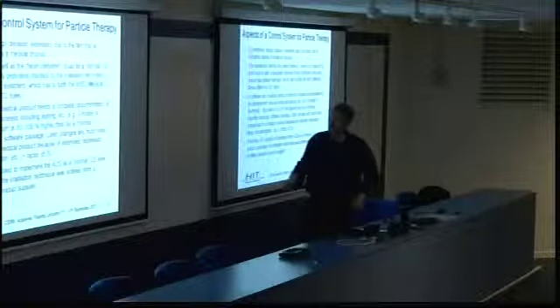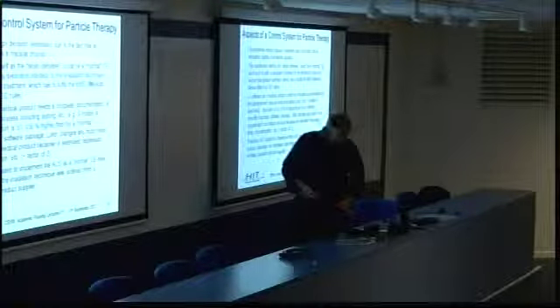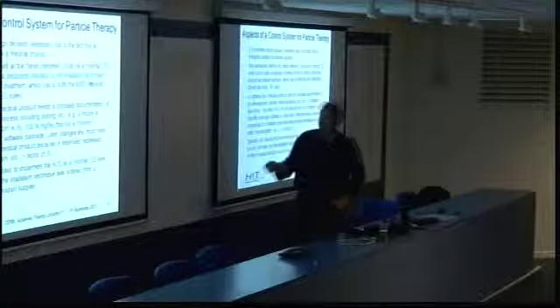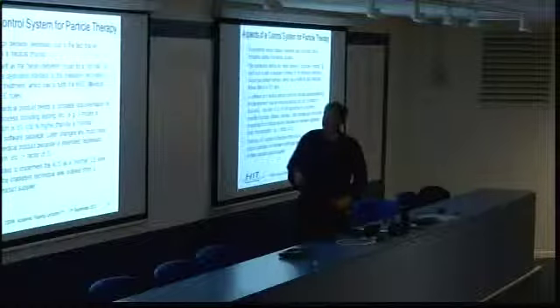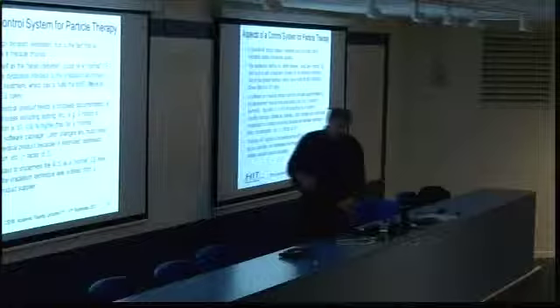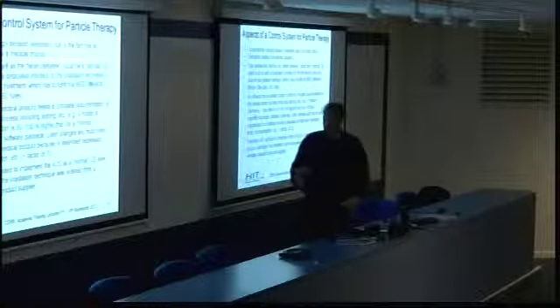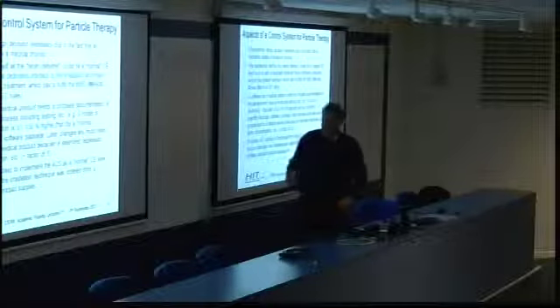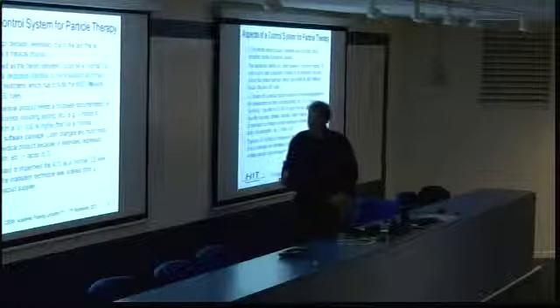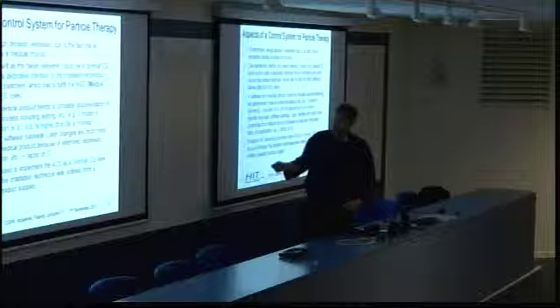I think this is a wise decision, because I just called our supplier some days before the talk and asked him, please tell me what is the work that you have to do if you make software for a control system or a normal scientific technical software package, and for a medical product. So he said to me that the effort is 50 to 100% higher for a medical software product for the first implementation.